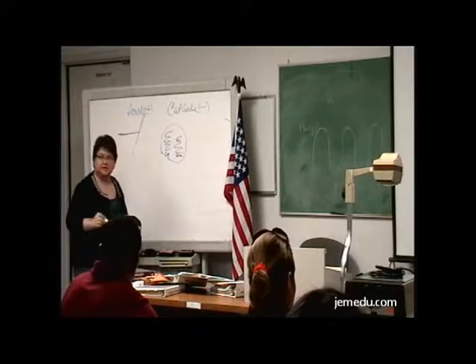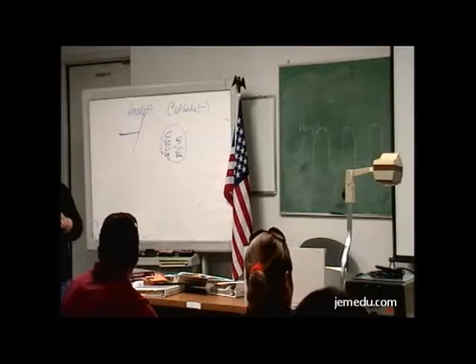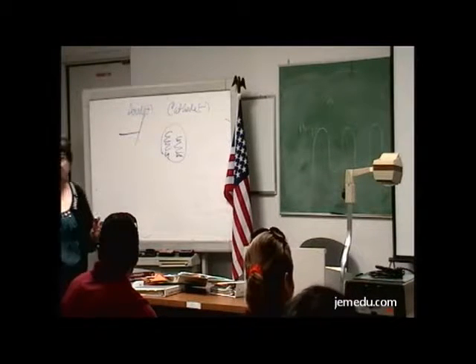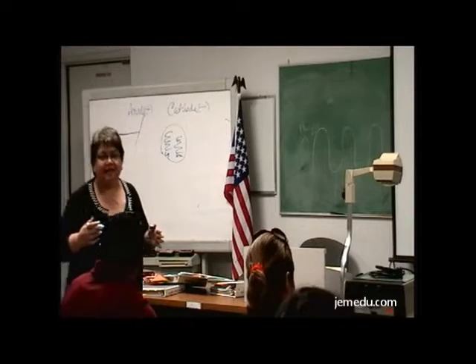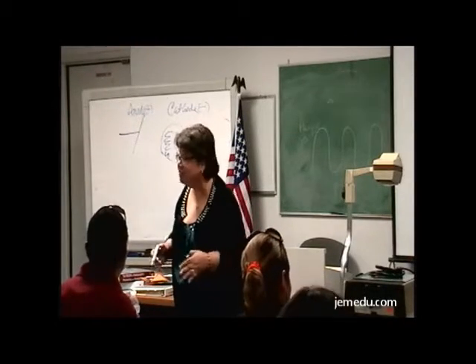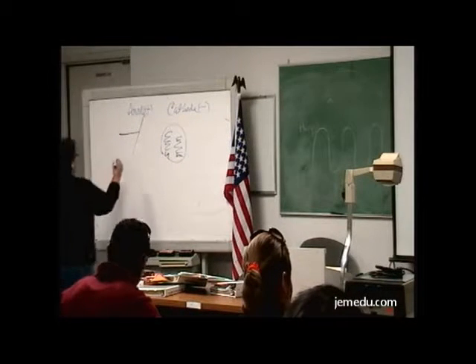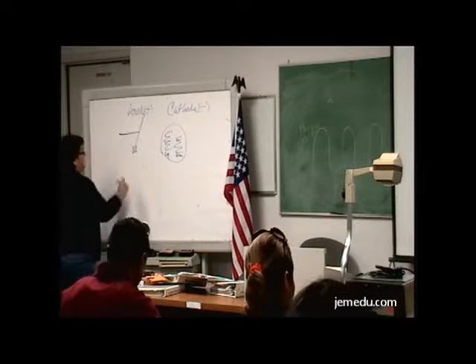So you focus the electrons. Focus the electrons towards what? Towards the target. What part of the target? The anode. Focal spot. The actual focal spot. So you're going to get a question about that. You know, where does it go?